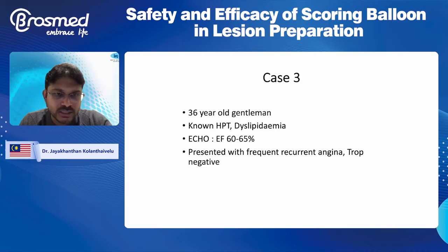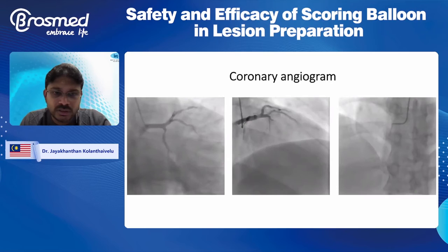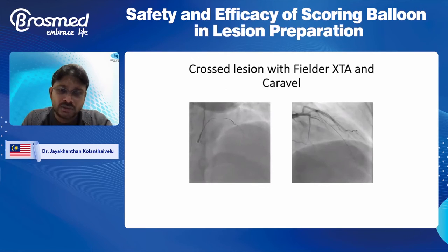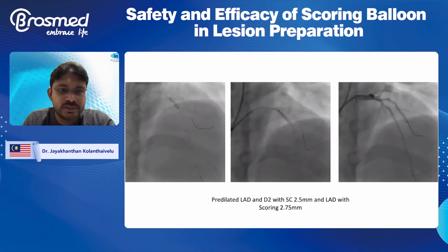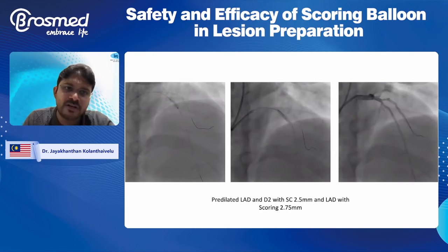I'll go straight to the third case. A 36-year-old young gentleman, hypertensive, dyslipidemic, preserved LV function, presented with recurrent angina. Troponin was negative. So his angiogram shows his circumflex and RCA were pretty pristine, but he had a totally occluded LAD. So single vessel, we went ahead and crossed it. It was not really a difficult lesion, to be honest. Pre-dilated initially with a semi-compliant, and then we used this 2.75 scoring.